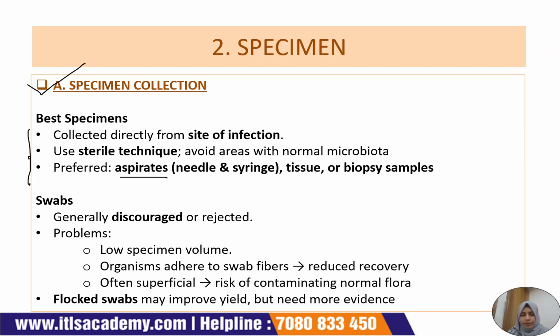biopsy samples. Now we have already discussed that swabs are generally discouraged or even rejected in some cases, but here are the problems mentioned. It involves low specimen volume. The organisms generally adhere to swab fibers, which reduces the chance of recovery of anaerobes in the laboratory.